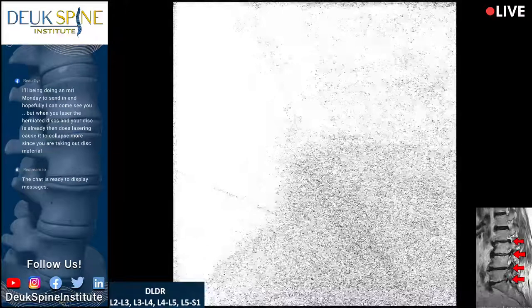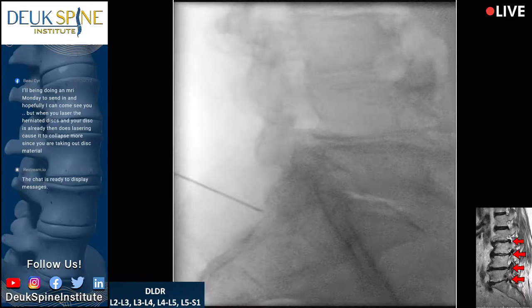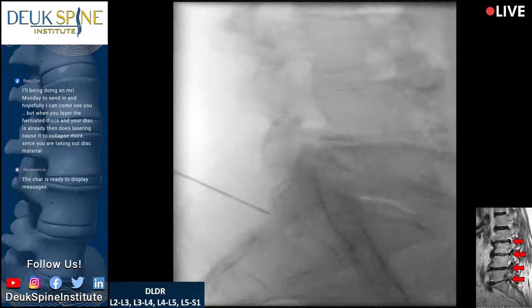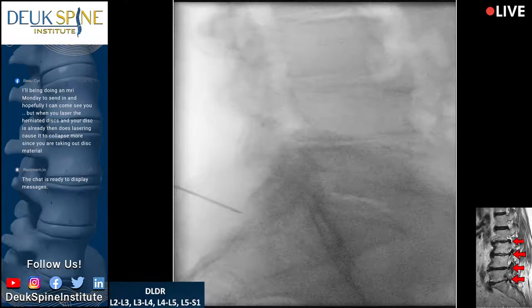Shot? Which is the L5-S1 disc. All right. So I think we're still off on orbit. Shot? See if you can get me a foramen at 5-1. I think that's worse, right? Go the other way. Shot. Shot. I don't know. Is that worse, Luis? I think try a little bit more. Yeah, your side height. Let's just put it this way. You're way off on orbit. You're either way off one way or way off the other way, and I just don't know which one it is. Keep going. Go. Yeah. Shot.